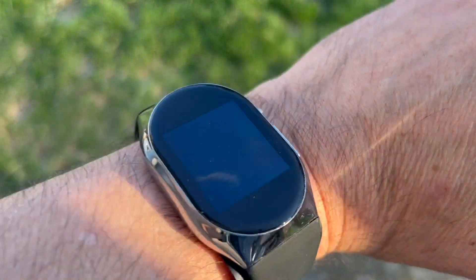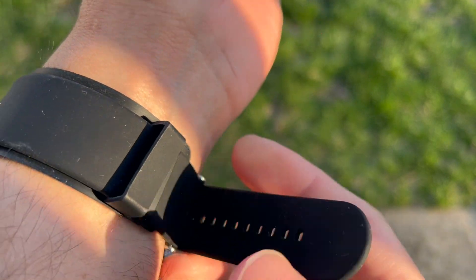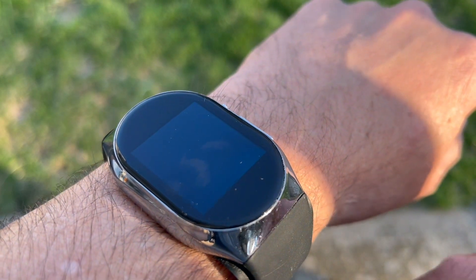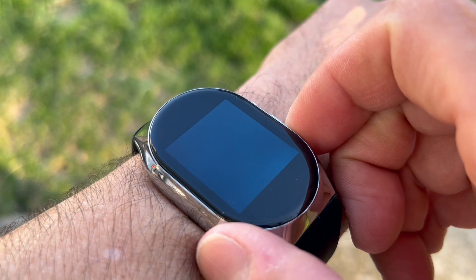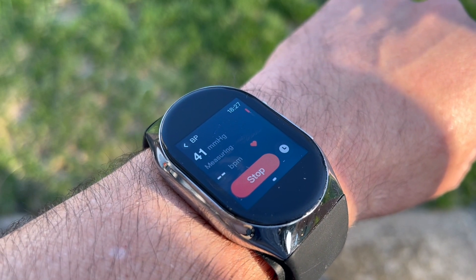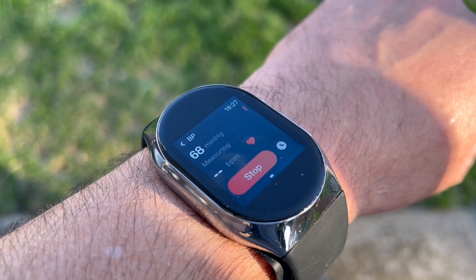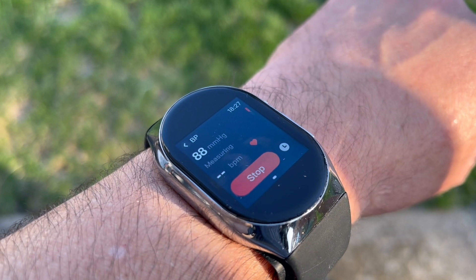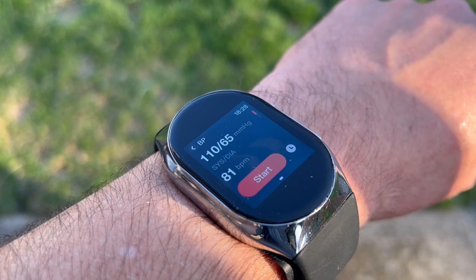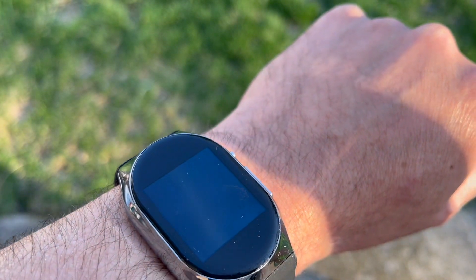I'm sitting down right now which is a good position. The watch tells you to tighten your band, and to keep your hand at the same level as your heart. Stay as still as possible for a good reading. The watch then inflates the cuff and takes the measurement. It reads 110 over 65 — if you drink coffee like I do it may have some impact on your reading.